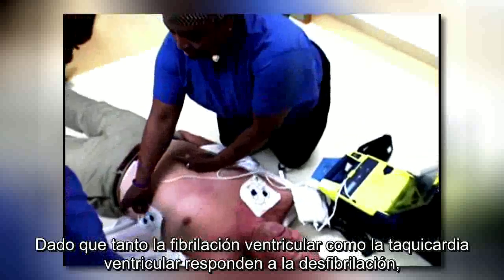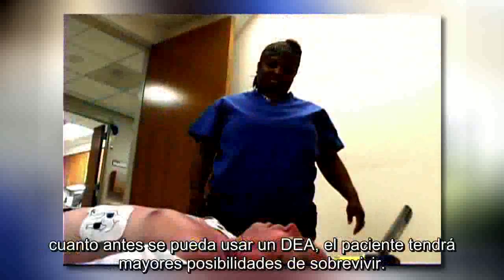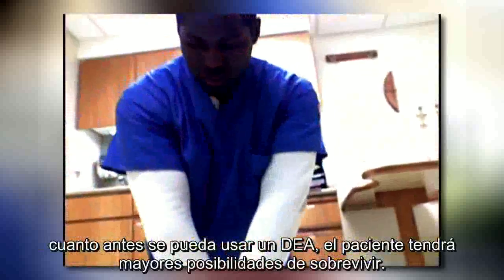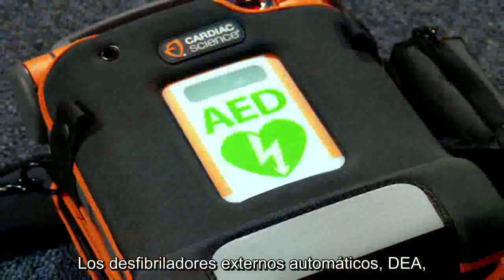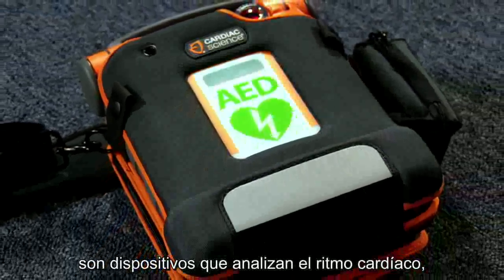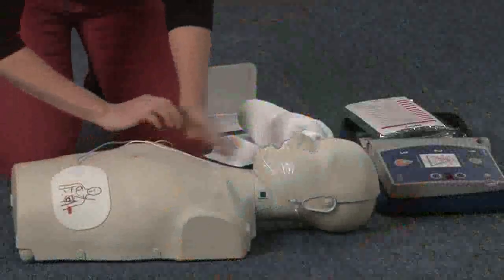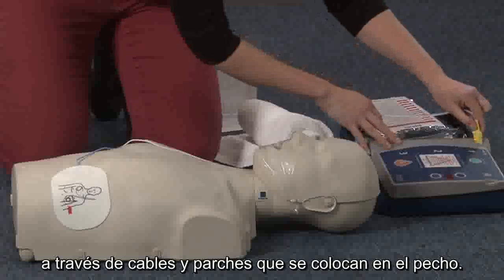Because both VFib and VTach respond to defibrillation, the earlier an AED can be used, the greater the chance a patient will survive. Automated external defibrillators, AEDs, are devices that analyze the heart rhythm, determine the need to shock, and deliver a shock through cables and pads adhered to the chest.